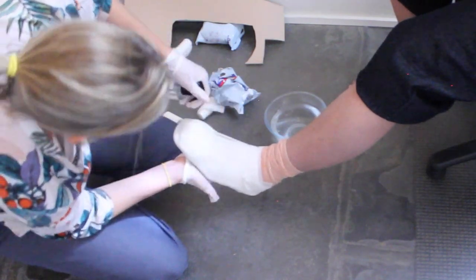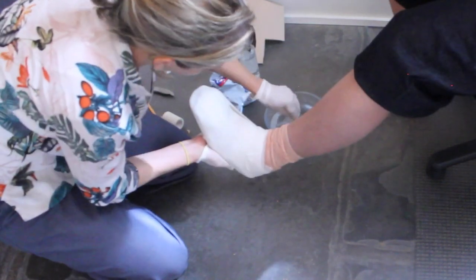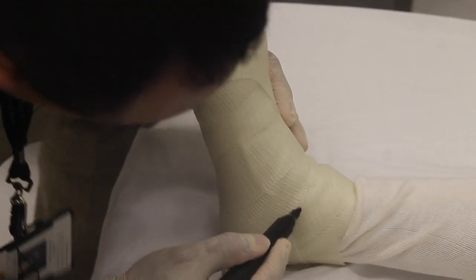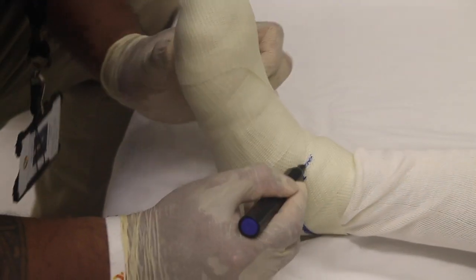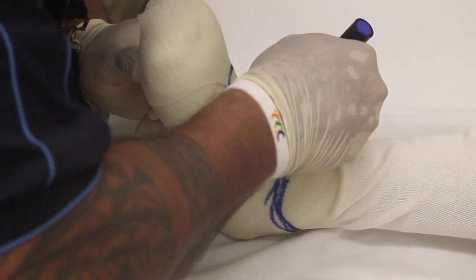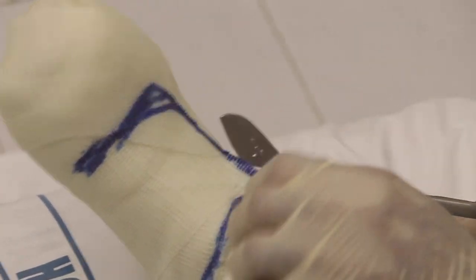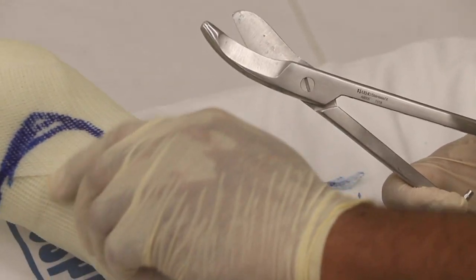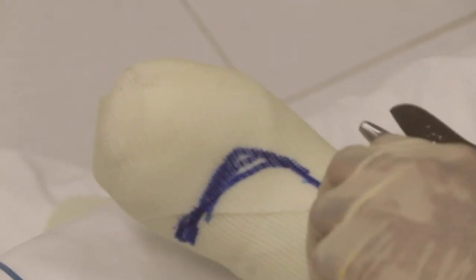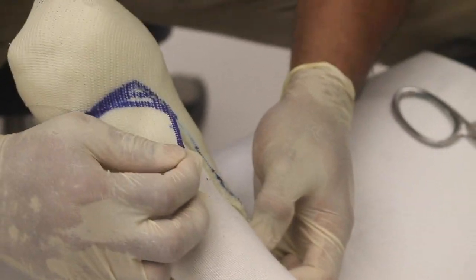Spray or wet hands and rub over the cast. Mark trim lines under the malleolae and low enough at the front and back of the ankle so the foot can dorsiflect and plantar flex. Cut a slit down the top of the foot, lateral to the midline, just before the level of the metatarsal heads. Cut through the top layer of the stockinette to make removal easier. Remove the shoe, being careful not to put pressure on the wound or ulcer.